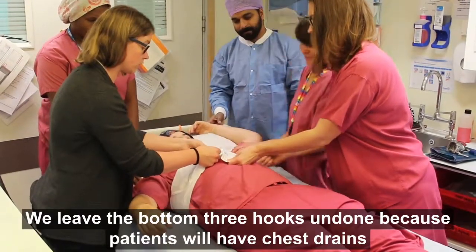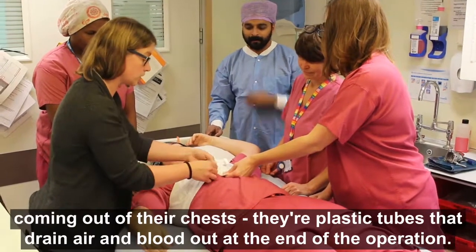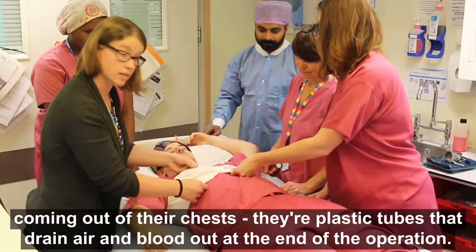We leave the bottom three hooks undone because patients will have chest drains coming out of their chest — plastic tubes that drain air and blood out at the end of the operation.